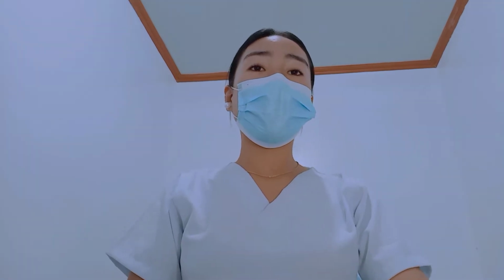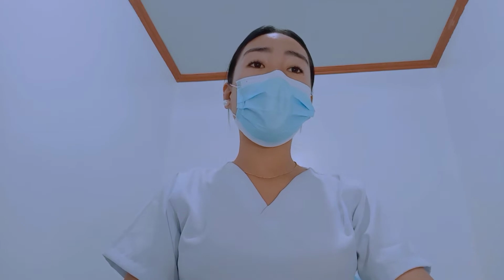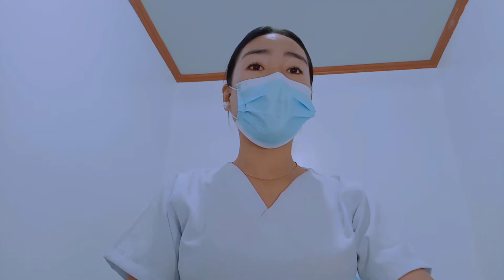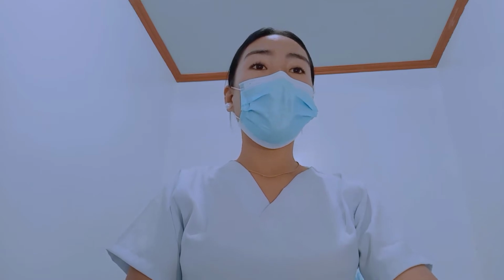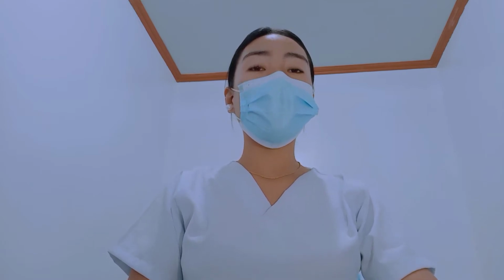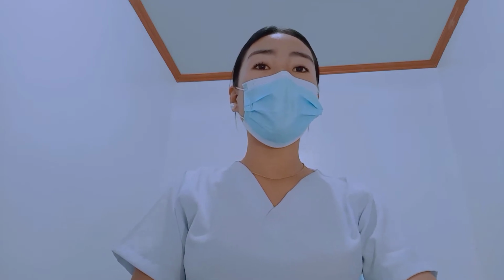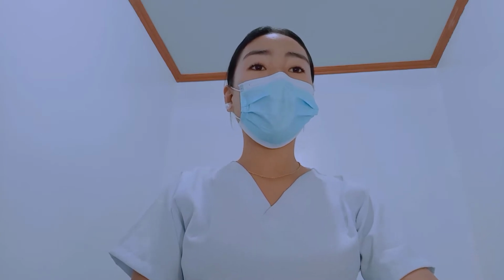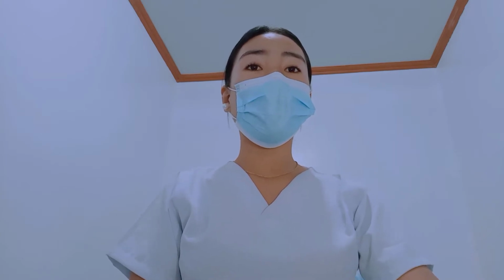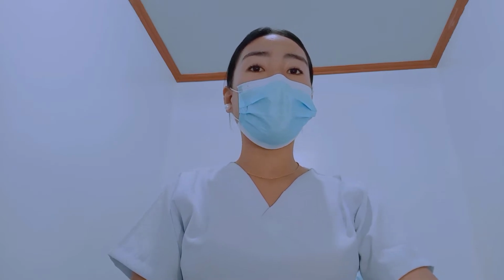Clean catch urine collection. Midstream clean catch urine collection is the most common method of obtaining urine specimens from adults, particularly men. This method allows a specimen, which is not contaminated from external sources, to be obtained without catheterization. It is important to follow the clean catch protocol in order to have accurate results from an uncontaminated sample.